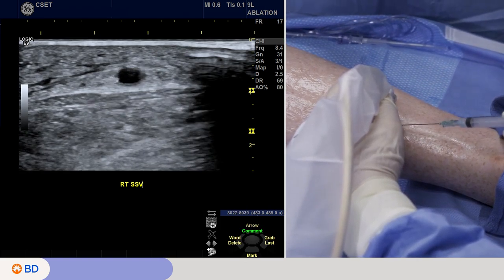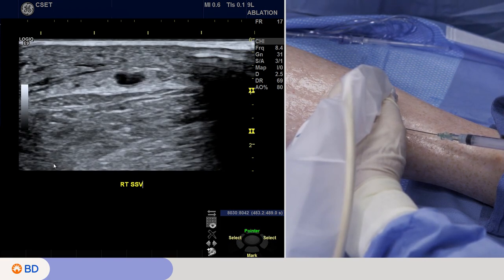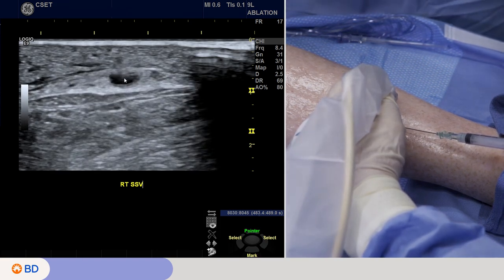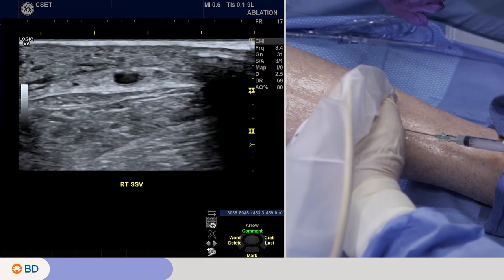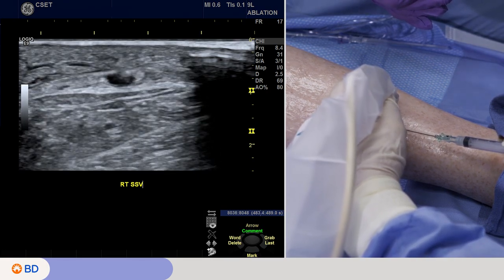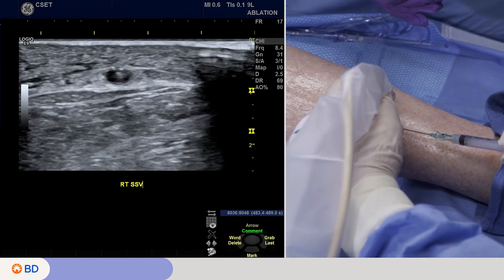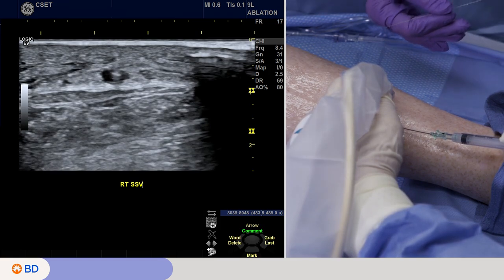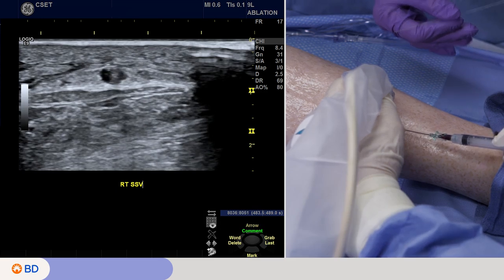I've got it numb and I'm going to stab through the skin. As you see on the ultrasound, I'm poking through on the front wall of the small saphenous — I'm intentionally showing you where I like to have the needle right in the middle of the circle. If you're off to the side it can bounce off, but I'm well positioned. I make a quick stab as I aspirate to see if I'm through. I don't have return yet — I think I was catching the front wall a little bit — and now I do.